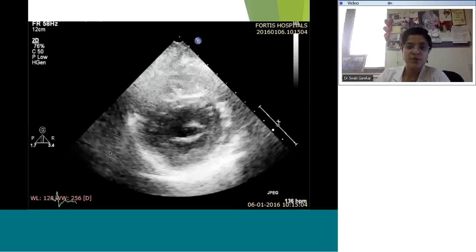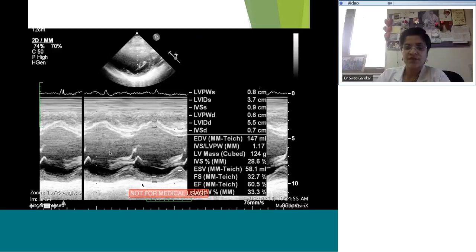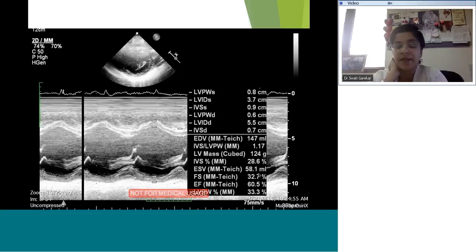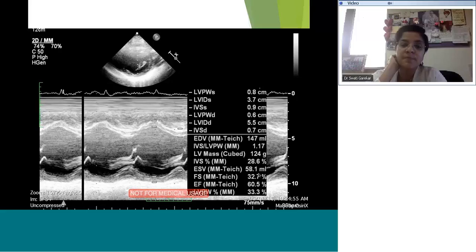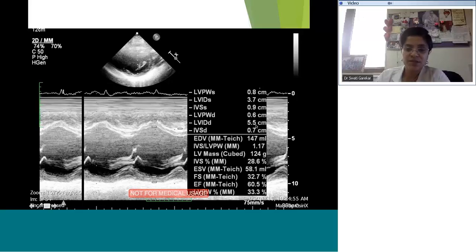The ventricle looks dilated but is contracting well — shortening fraction of 32%, ejection fraction of 60%, end-systolic volume of 58 ml. The end-systolic volume indexed upwards of 55 ml/m² is considered an indication for intervention, as it means even at end-systole you're left with a significant amount of blood in the LV. The LV diastolic dimension is 5.5 cm — very abnormal for this child. The end-systolic dimension is 3.7 cm — always get a Z-score for those as well.